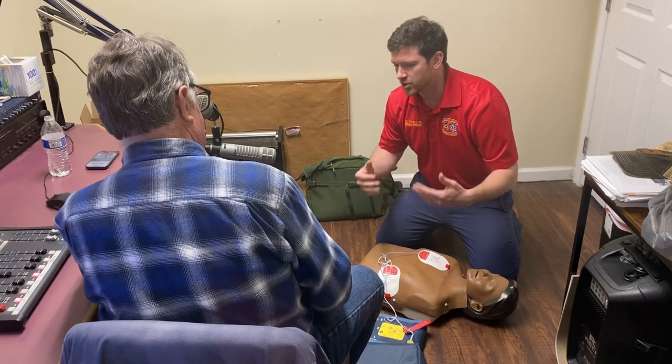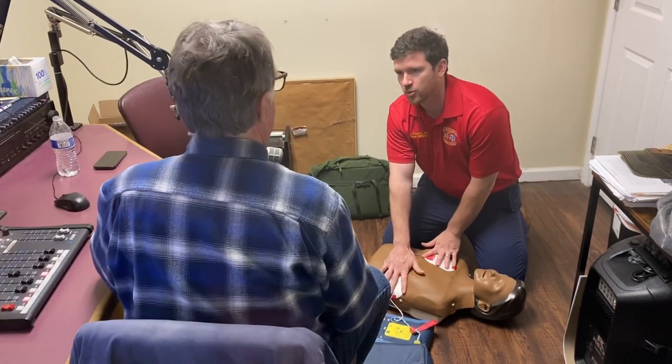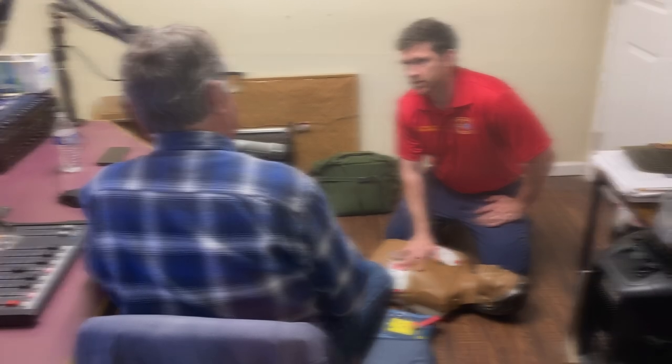It'll tell me to stop and not touch the patient so it can listen to the heart rhythm and interpret that. And it'll tell you to shock if needed. It listens, it will interpret the heart's rhythm, and it'll shock if needed. It will not hurt a person if they're alive — it will only shock certain rhythms. And so that's really good.